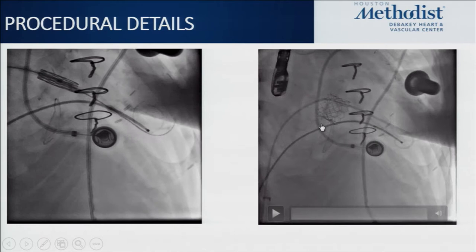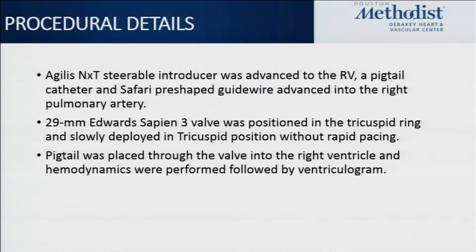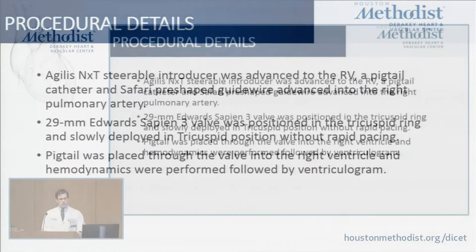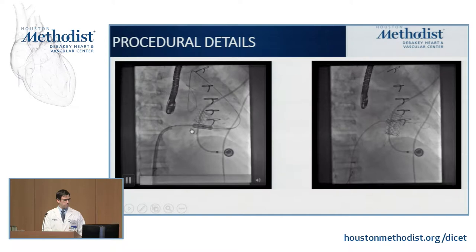Next, attention was turned to the tricuspid valve. The sheath was pulled back across the atrial septum and switched back to the Agilis catheter for better maneuverability. Using a pigtail catheter, the Safari wire was advanced into the distal right pulmonary artery to provide a rail — here you can see the Safari wire out through the RVOT into the right pulmonary artery, providing good support.